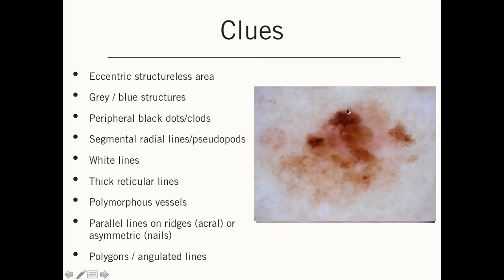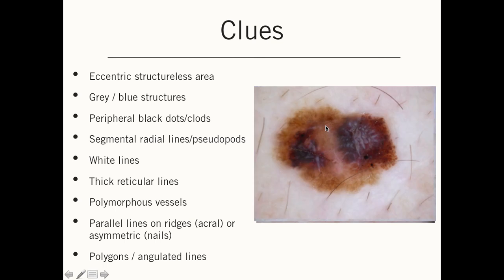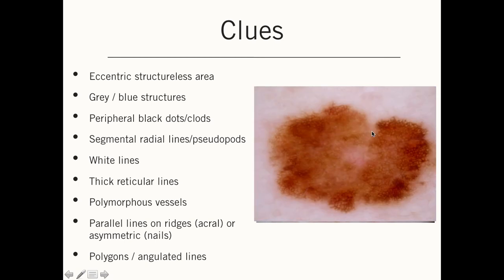Here we have black clods and dots that are eccentric — those are a clue to malignancy. Here we have radial lines, but they are only in a segment of the lesion; they do not anchor around the whole circumference, just a segment — and because of this, it is a clue to malignancy. Here we have white lines, and most commonly they will present as perpendicular white lines, seen by polarized dermatoscopy. Thick reticular lines are a more difficult clue — when the lines themselves are thicker than the holes in between, that counts as a clue to malignancy.